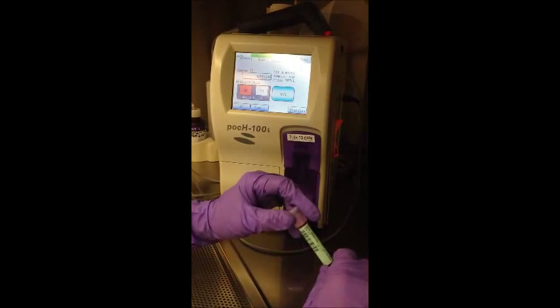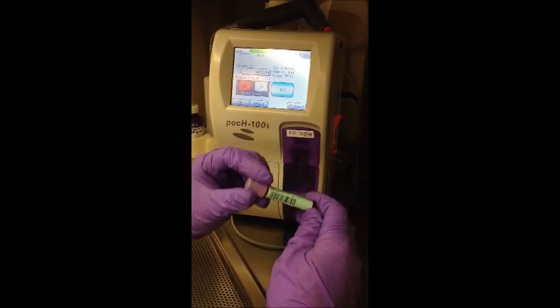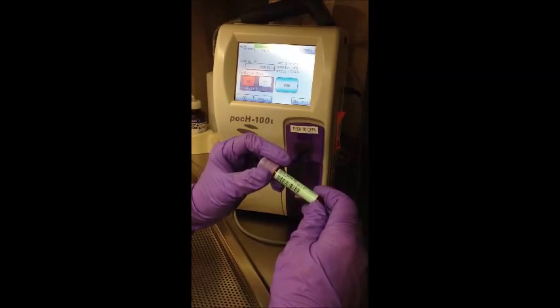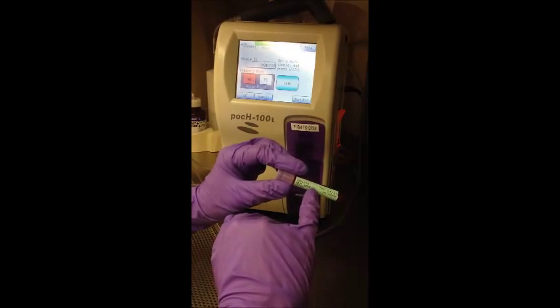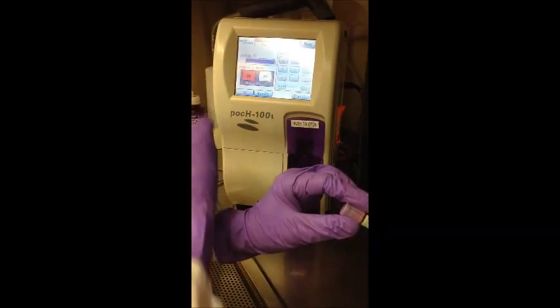And now we're going to run a patient sample. The Ebola sample will not have a barcoded label such as this, but it will have an addressograph label, and please use the MRN number of the addressograph as a sample ID.